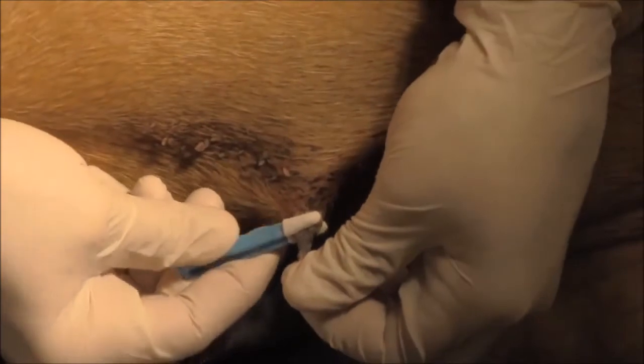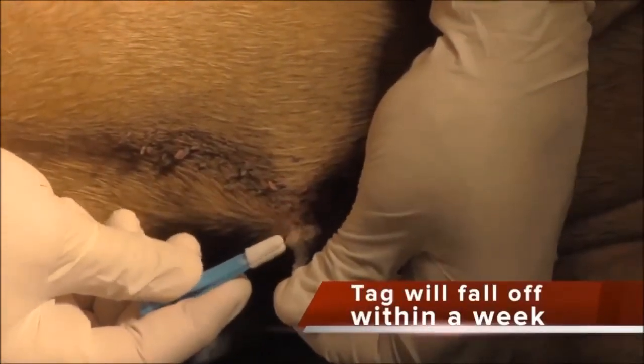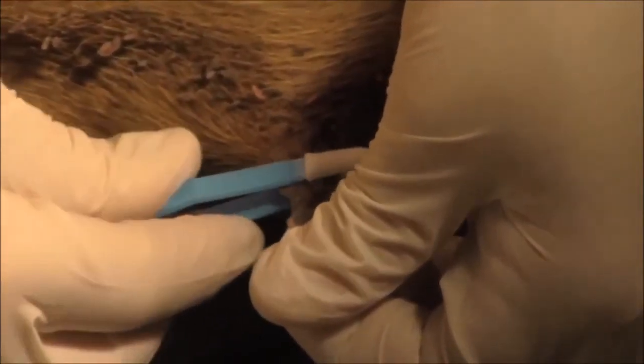Alright, that shows our end result. What will happen is this thing will slough off — probably within a week it will just fall off.